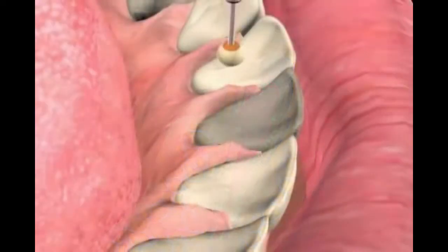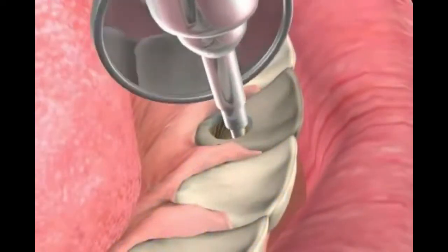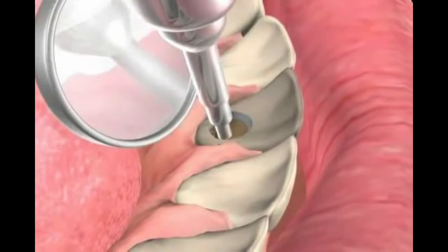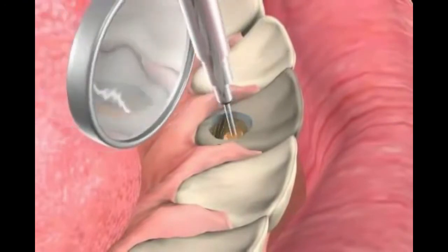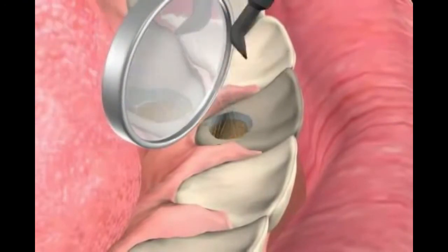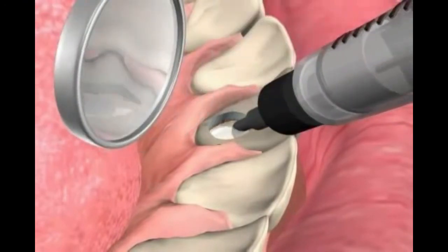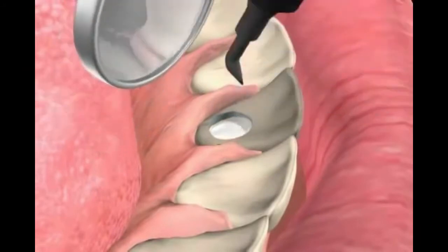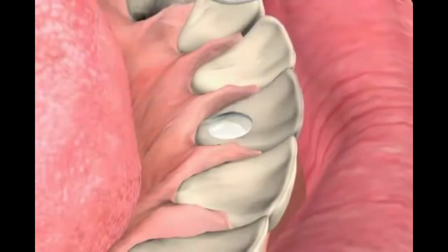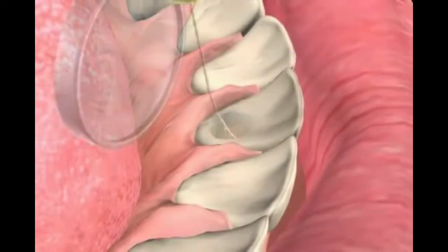The objective of internal bleaching lies in the removal of the tooth discolorations without sacrificing any of the hard tooth substance. A special gel is inserted into the interior of the tooth, neutralizing the discolorations.